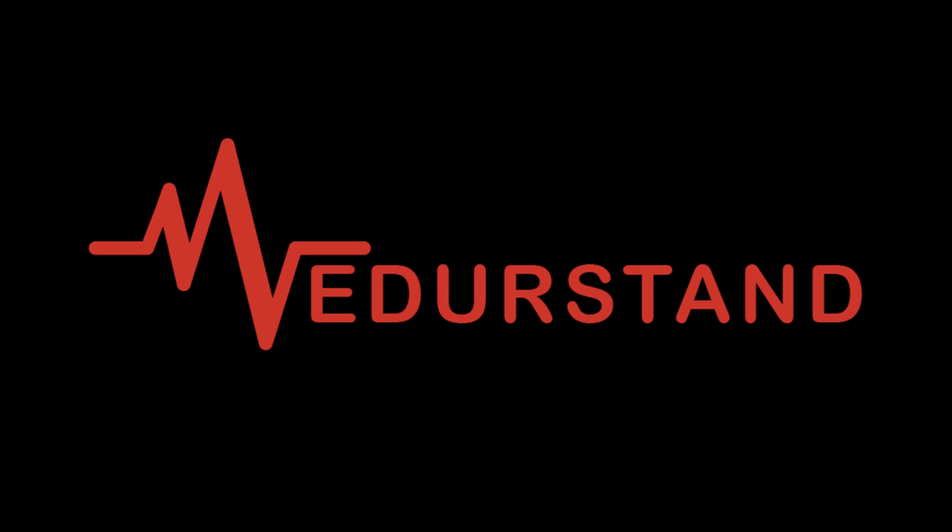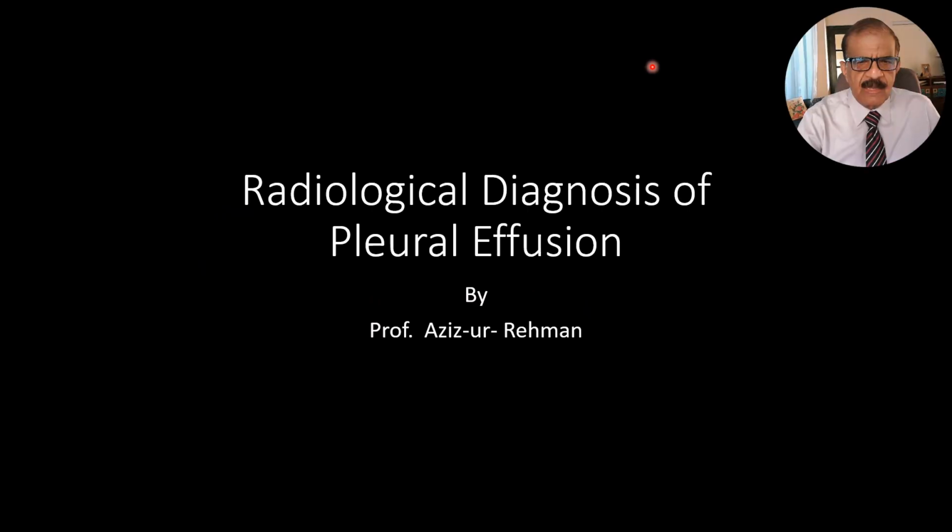Understanding Medicine. I'm Professor Aziz-ur-Rehman, and today we are going to discuss the radiological findings of pleural effusion. Pleural effusion is a very common condition, and there are various causes and various types, and there are various imaging techniques that we can use to pick up this very important condition. So I will go through very briefly the various radiological appearances.